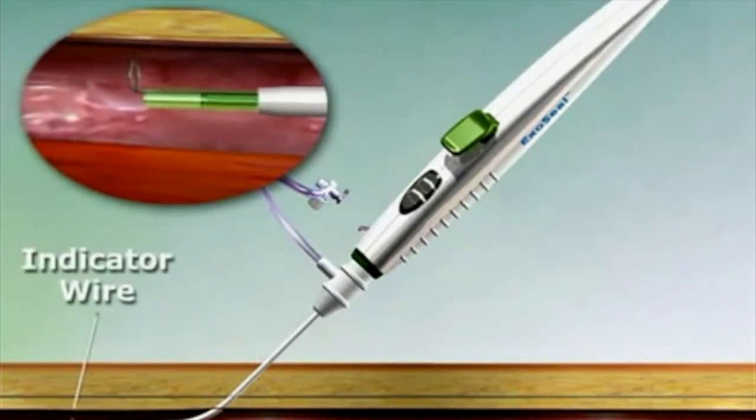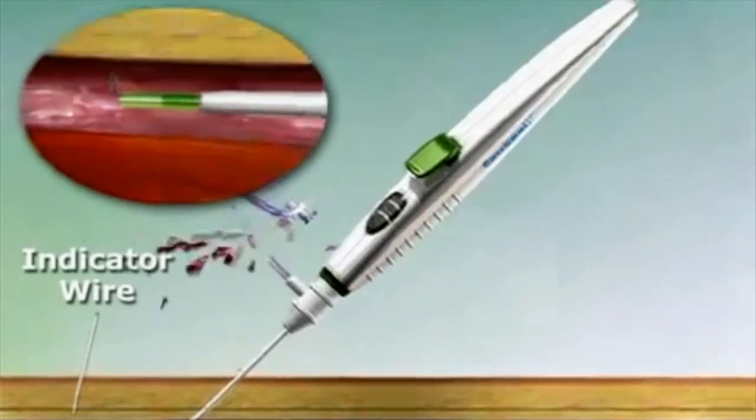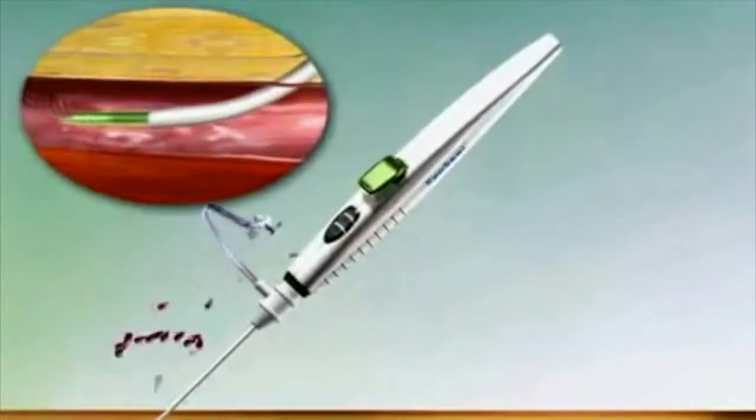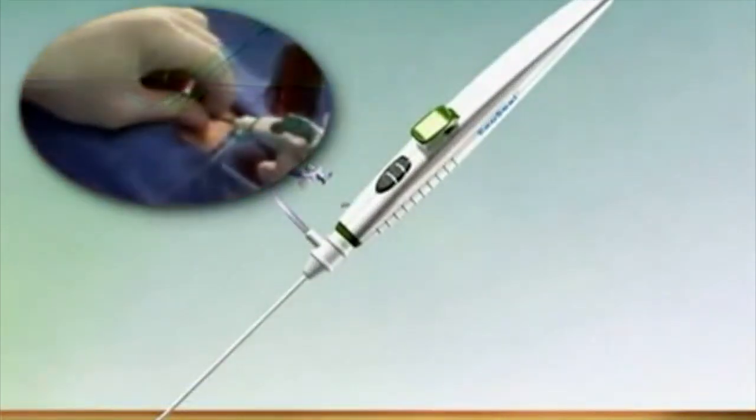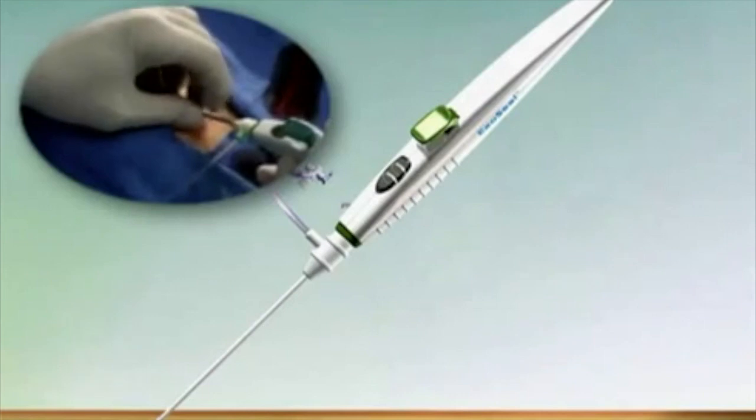Slowly retract the ExoSeal device and the femoral sheath as one unit following the angle of the tissue tract less than or equal to 45 degrees until pulsatile flow has significantly slowed or stopped from the bleed back indicator.